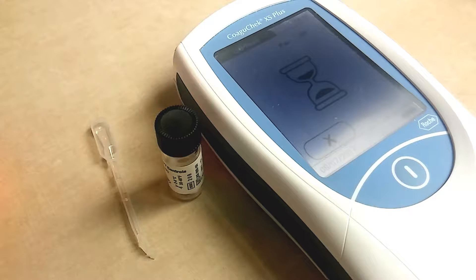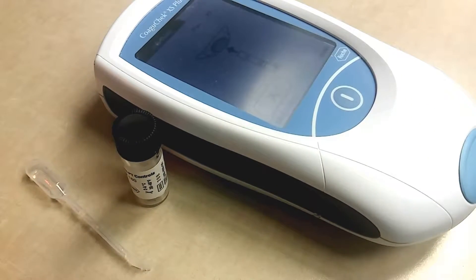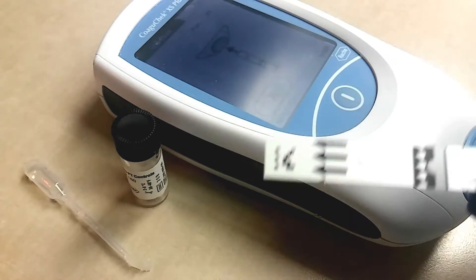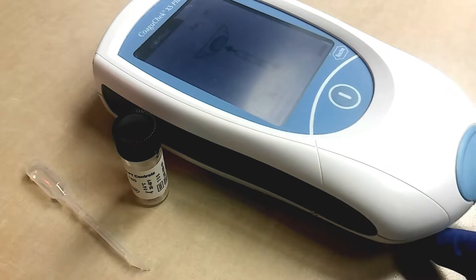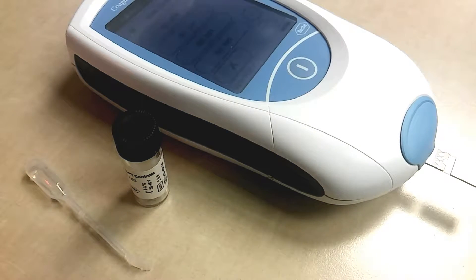That's the loading screen. Now it says you want to enter your testing strip. This is what it looks like. You're going to insert it here at the bottom and put it in nice and firm.